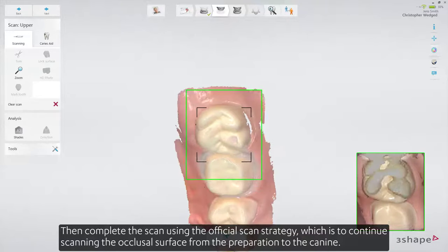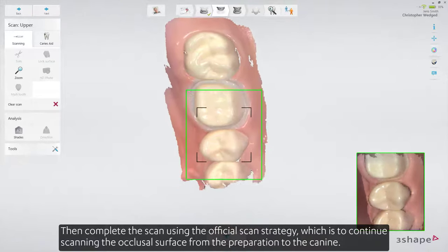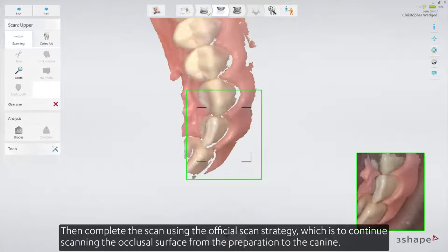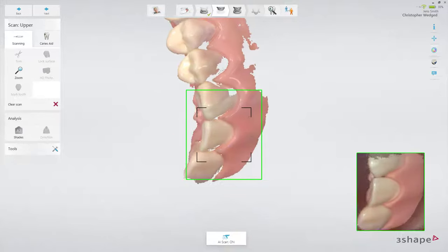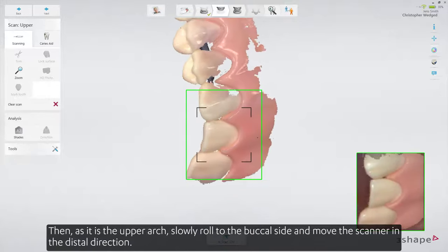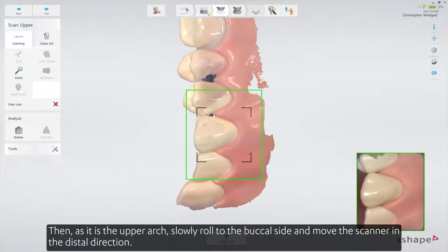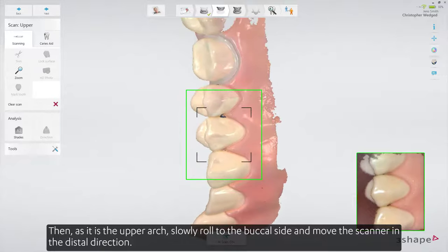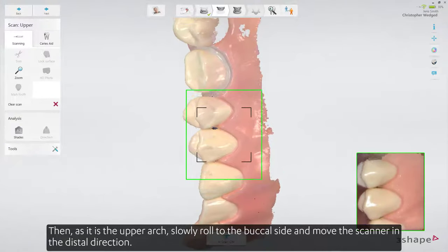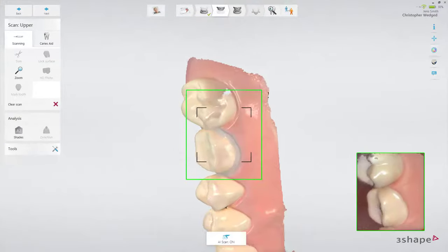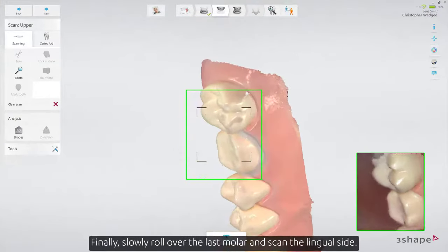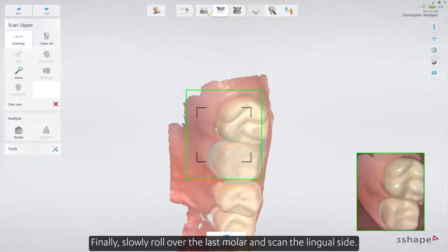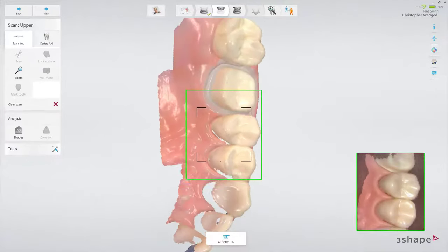Then complete the scan using the official scan strategy: continue scanning the occlusal surface from the preparation to the canine. Then, as it is the upper arch, slowly roll to the buccal side and move the scanner in the distal direction. Finally, slowly roll over the last molar and scan the lingual side.